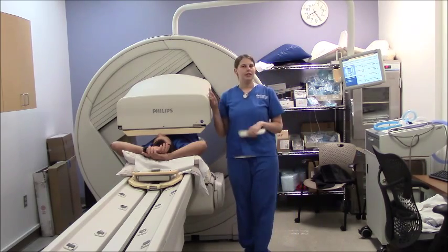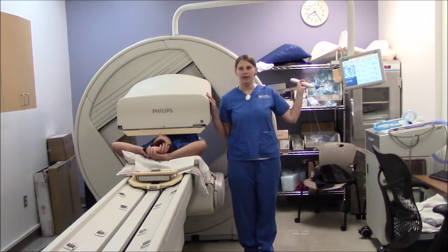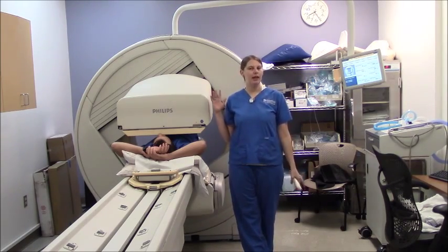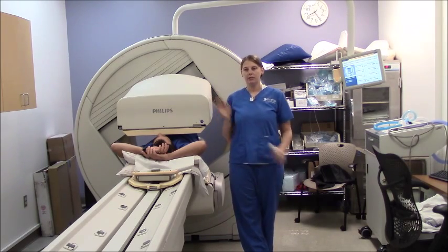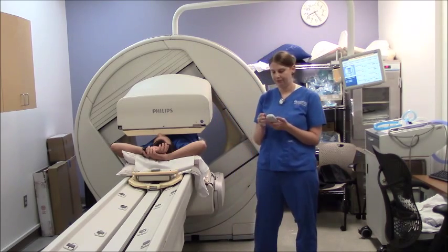Now that my cameras are nice and close to my patient and my whole lungs are in the field of view, I can start my image. This image will run for about 5 minutes, maybe less. Once this image is done, we'll move the cameras away and move into our next set of images.